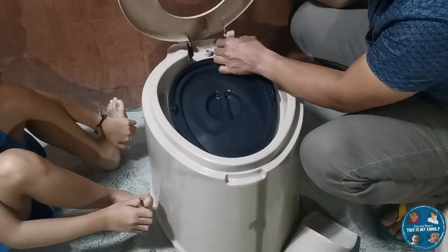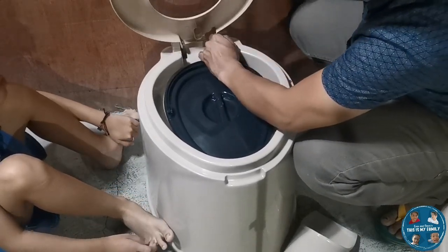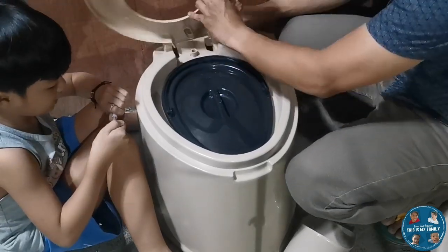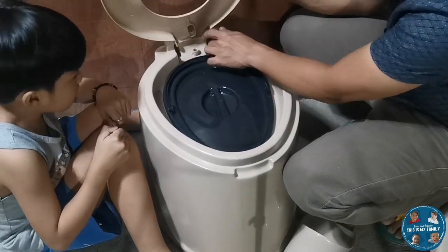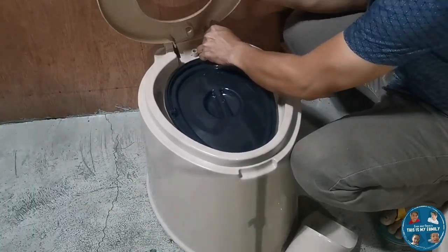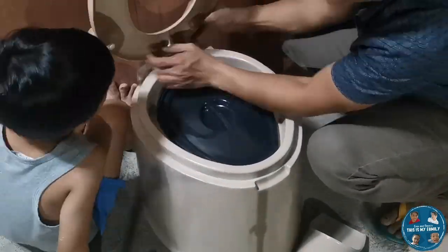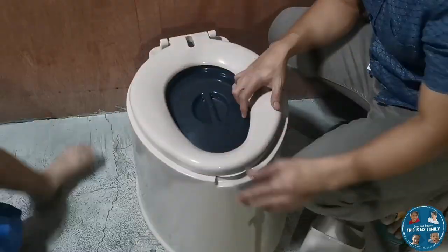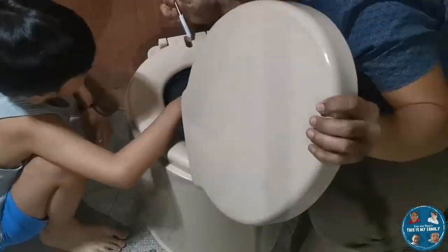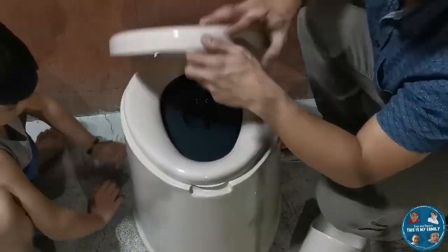Installing this is quite easy — you just need to put in the plastic screws. Even a little child can do this. I believe you can install this item in at least three to five minutes, that's how easy it is to install the portable toilet.